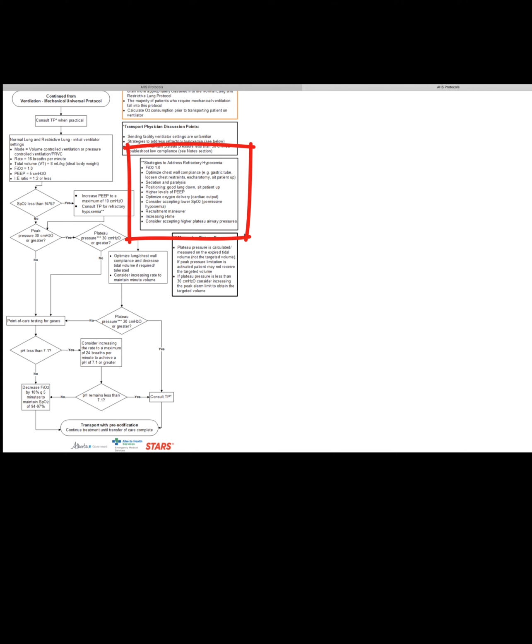If you have a burn patient, an escharotomy can help. And sitting the patient up is an easy thing to do, especially with our larger patients. They have a lot of soft tissue to move with every breath. And if we can sit them up, we offload the lungs, we offload the soft tissue from the chest wall, and we should improve compliance. That should have been the first thing on the list. Exactly. We can probably reorder that. That's a pretty easy switch.